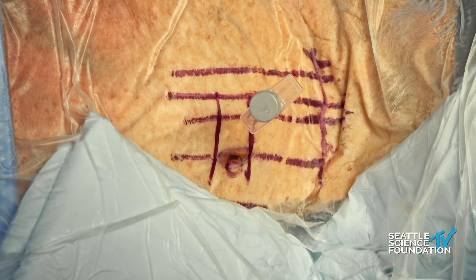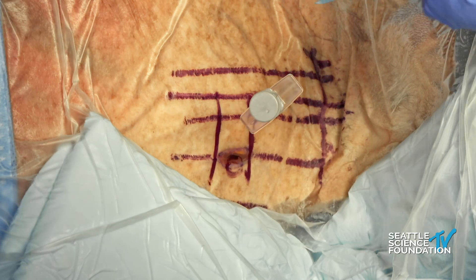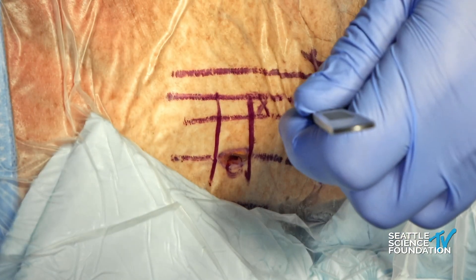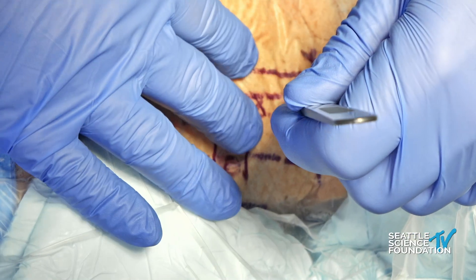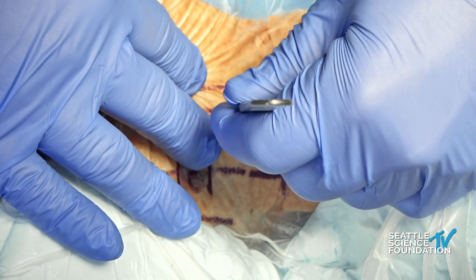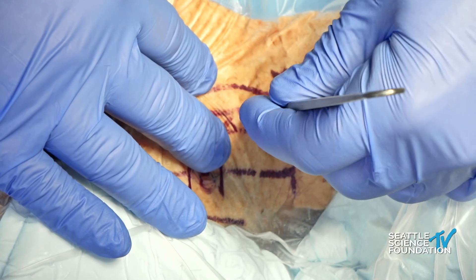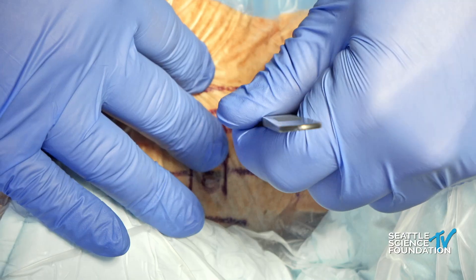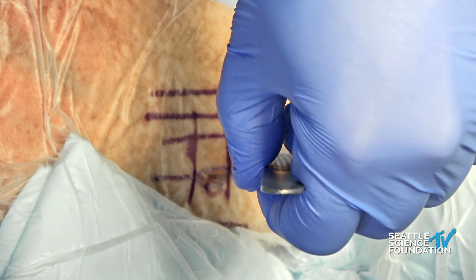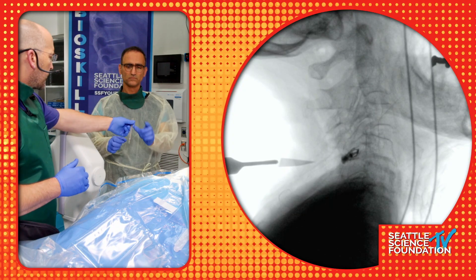One very important thing in the cervical spine when you approach is that you cut the fascia. Take an 11 blade, make the incision, and also make the incision through the fascia so you can advance in there. Not too much — you don't want to cause any unnecessary bleeding. X-ray confirms we're pointing right at the right spot.